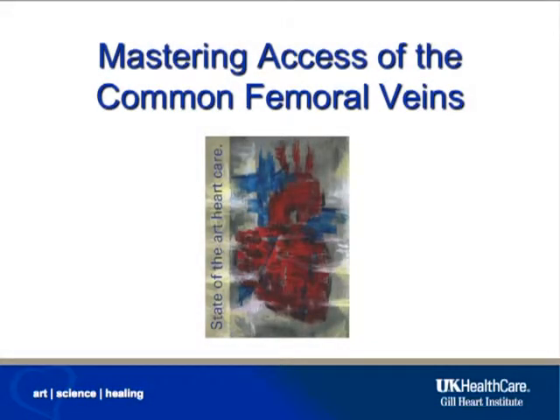Access through the common femoral veins is often required for a number of procedures, both therapeutic and diagnostic. We will discuss mastering access of the common femoral veins in terms of understanding the anatomy and how to properly advance catheters and wires to avoid complications.